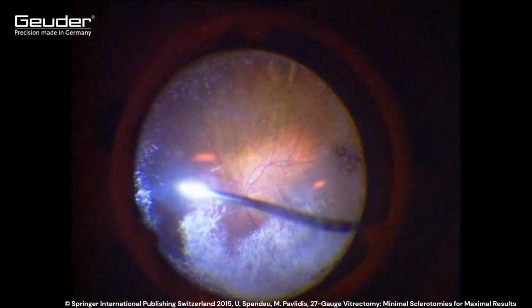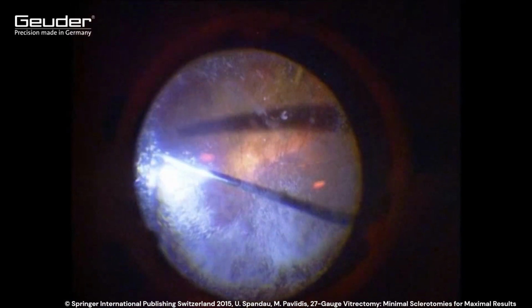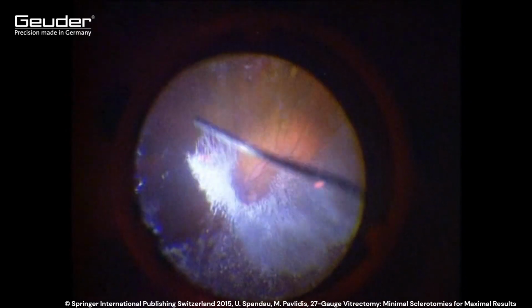It can be clearly seen how vitreous body strands are aspirated and cut and how the removal of the vitreous body progresses.